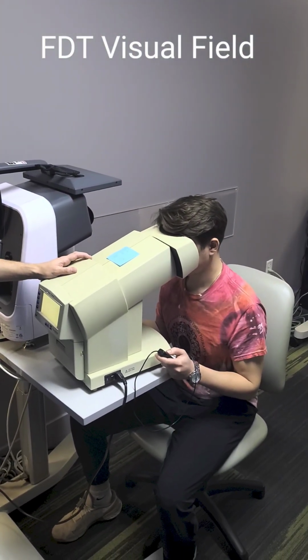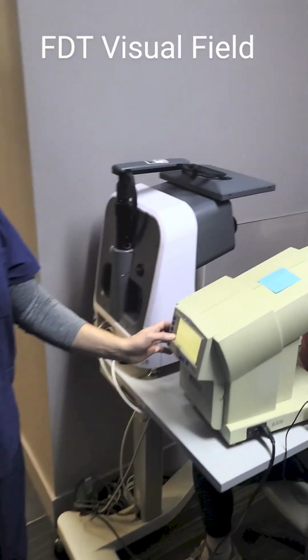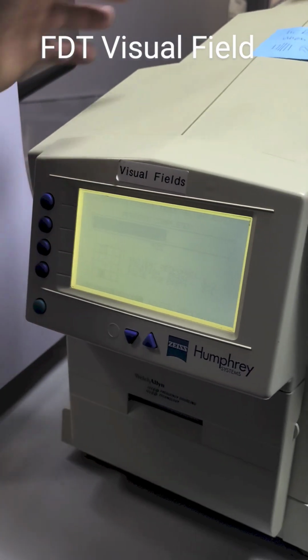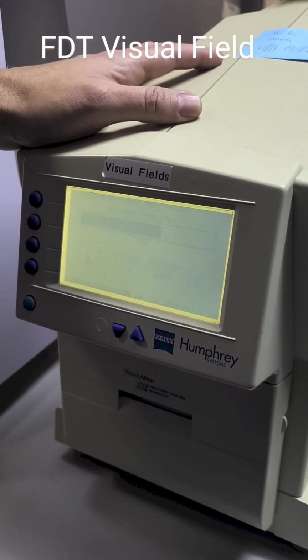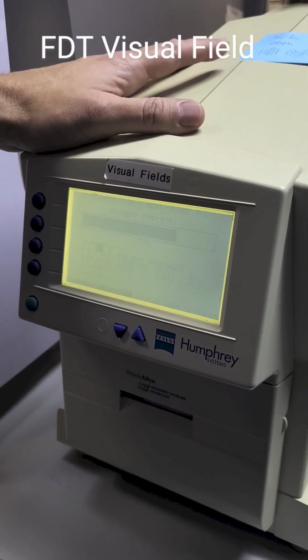And the test will take about 1 minute per eye. Little map on the screen shows you exactly where the stimuli are being presented to the patient, and make sure the patient is complying with the instructions you gave them as they're taking the test.